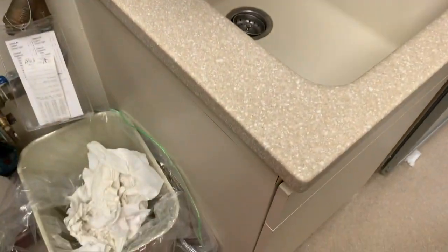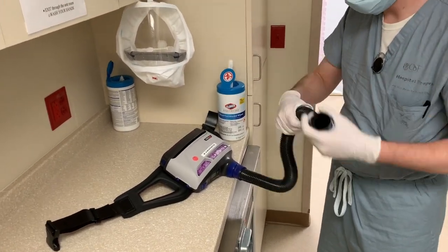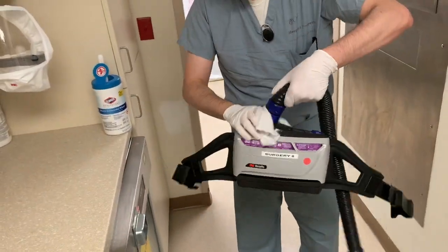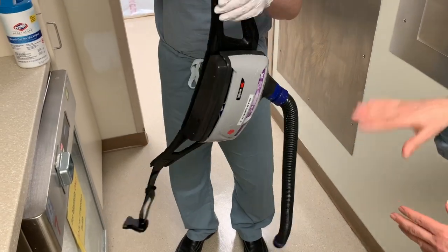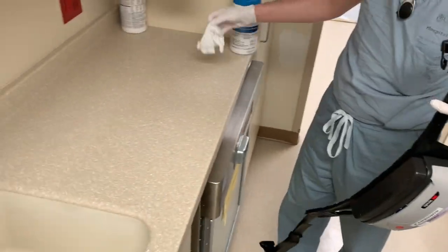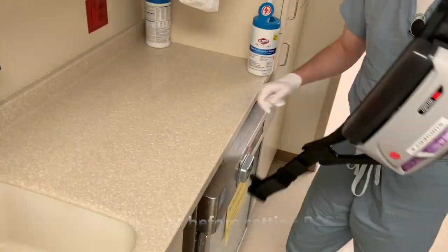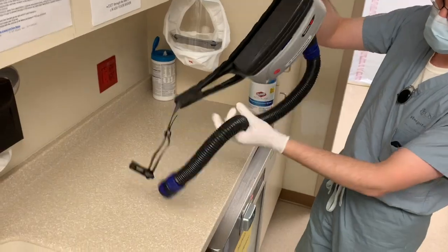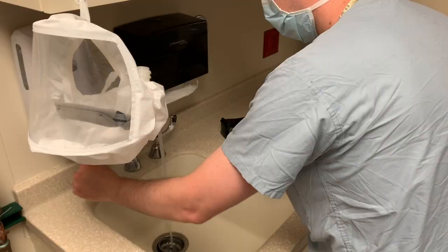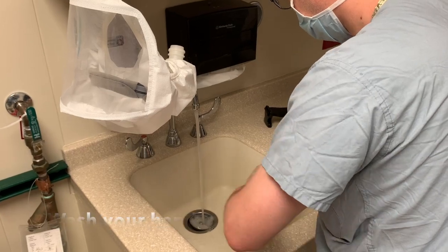You then grab another wipe and wipe down the entire PAPR unit with the hose, the battery pack, the power pack, and the waist belt. You want to make sure it doesn't touch the ground or counter in the meantime, because you have to wipe down the counter completely with the bleach wipe again and then set down the PAPR. You are then going to remove your gloves and wash your hands.